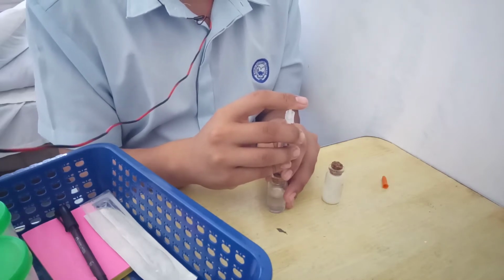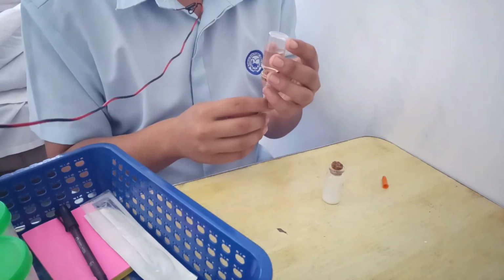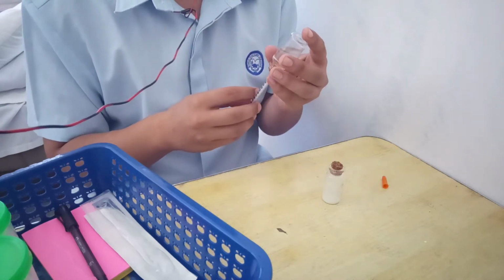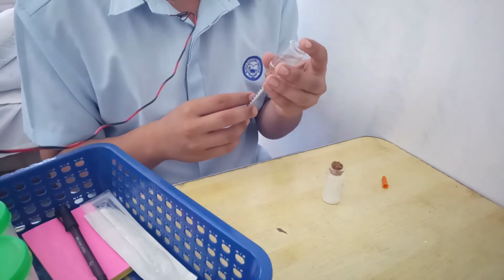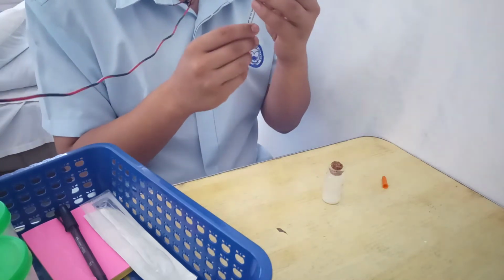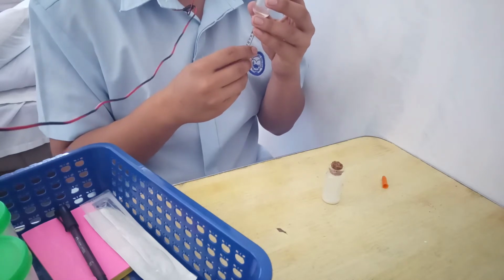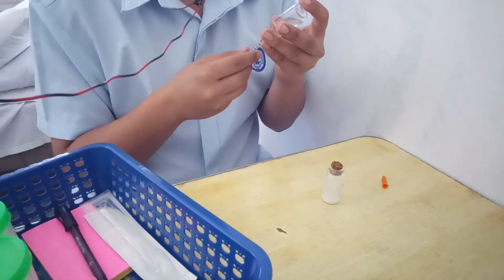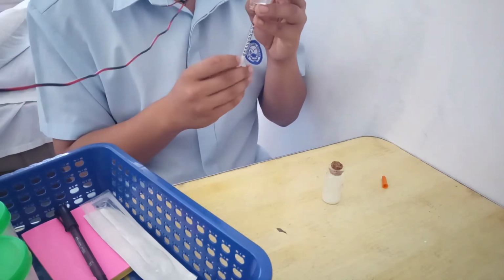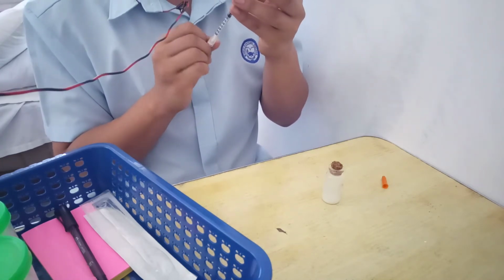With the insulin syringe and needle attached, turn the clear insulin vial upside down. After that, with the needle bevel within the insulin, withdraw the required amount of clear insulin into the syringe. Make sure it is at eye level or vertical. So for the clear insulin, since we inserted 20 units of air, we will also withdraw 20 units of insulin. Make sure it is at eye level. 20 units.